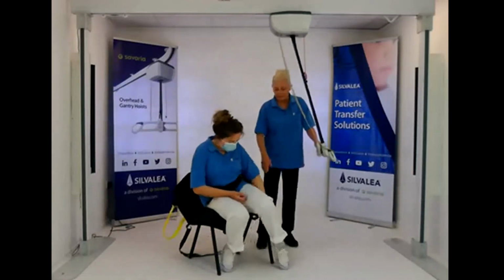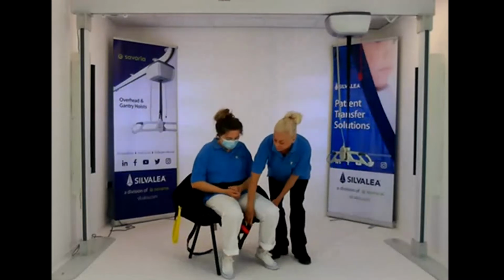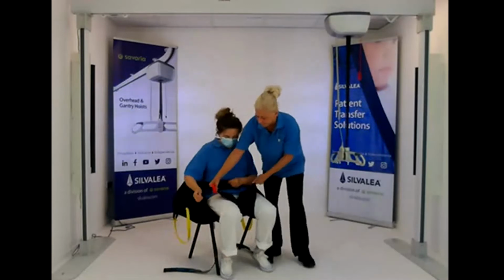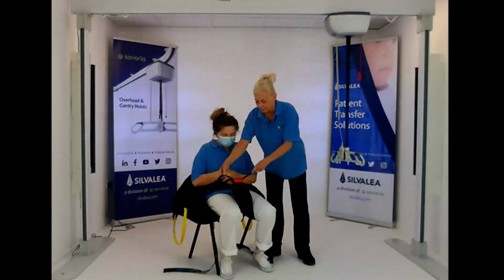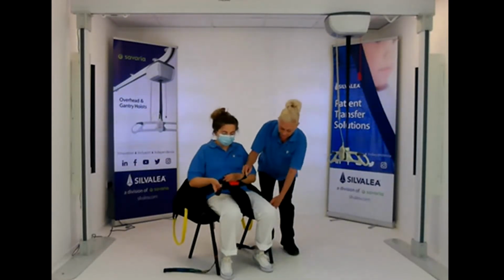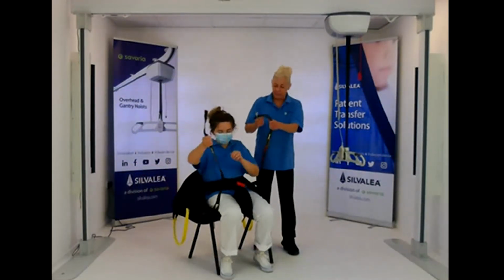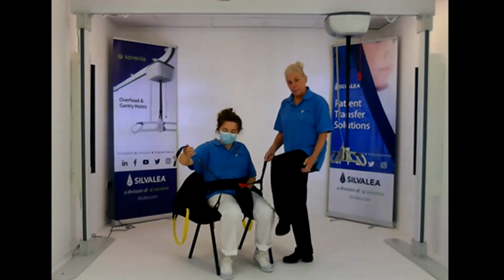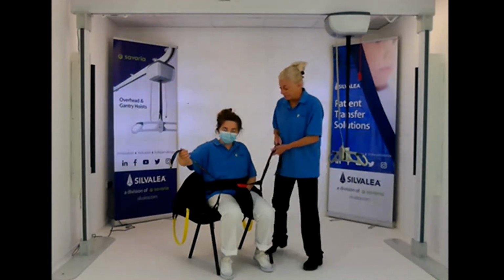The leg sections have a slip type fabric on both sides to help with the insertion. So they wrap around the femurs here, like that. And then there's a red modesty loop that connects them together. And then the outer tape feeds through. You can see here, we're then getting a pickup from the outside of the leg, which is really good to give more support to the outside and the hip.